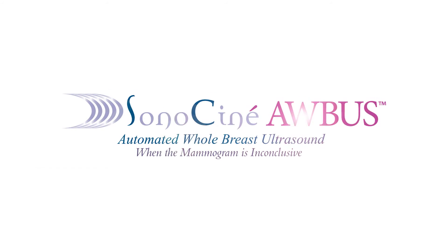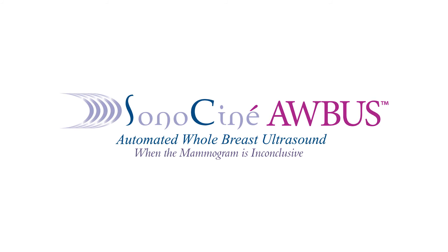And if your doctor wants to compare last year's exam to this year's exam to see what changes may have occurred, he or she can. So there you have it — are you ready for your close-up? Get the whole picture with the SonoCine AWBUS examination. Finally, you can have peace of mind beyond your mammogram.